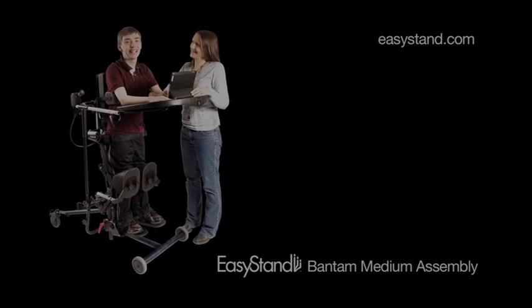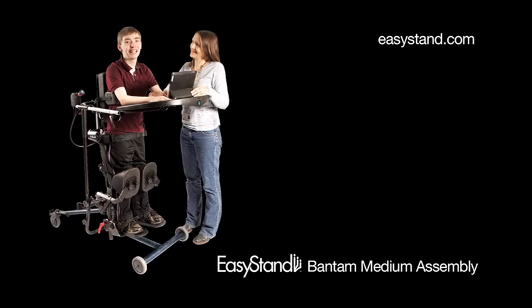Your Easy Stand Bantam Medium is now fully assembled. Visit easystand.com for more information.